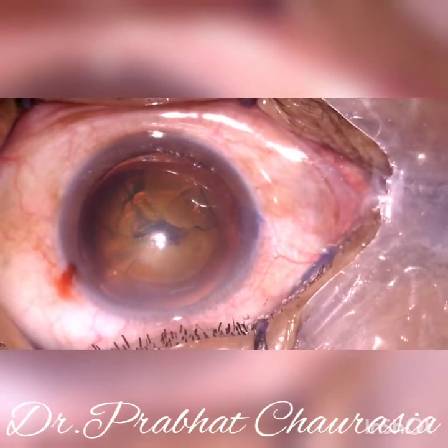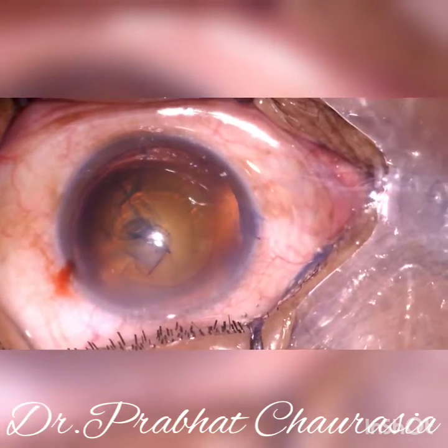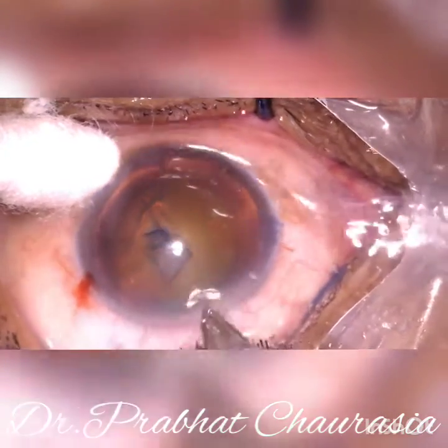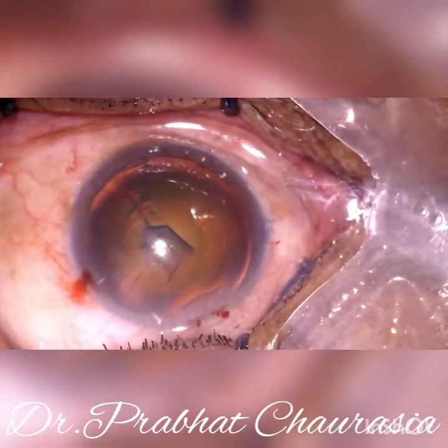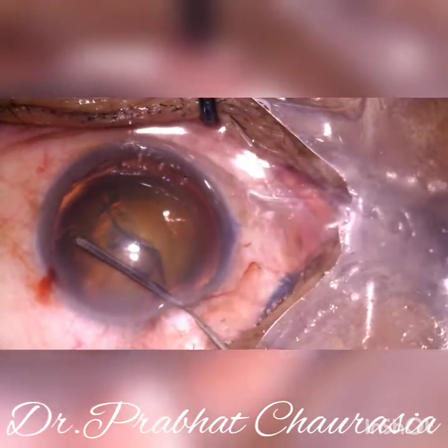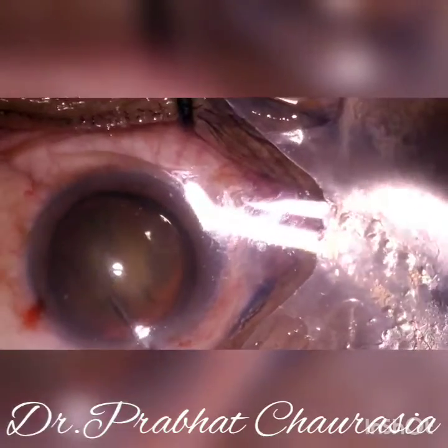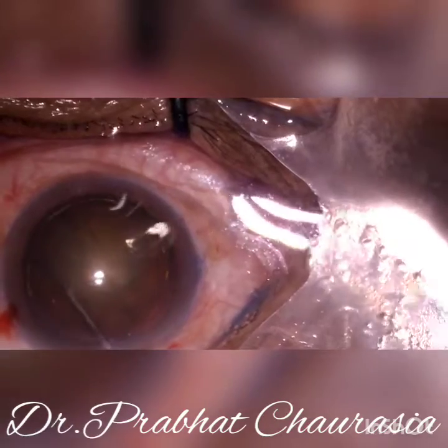Inject some HPMC and then make the posterior limbal main port — it is a posterior limbal incision. Then perform the hydroprocedure: hydrodelineation and hydrodissection. Tap the nucleus slightly and gently, and try to rotate it.